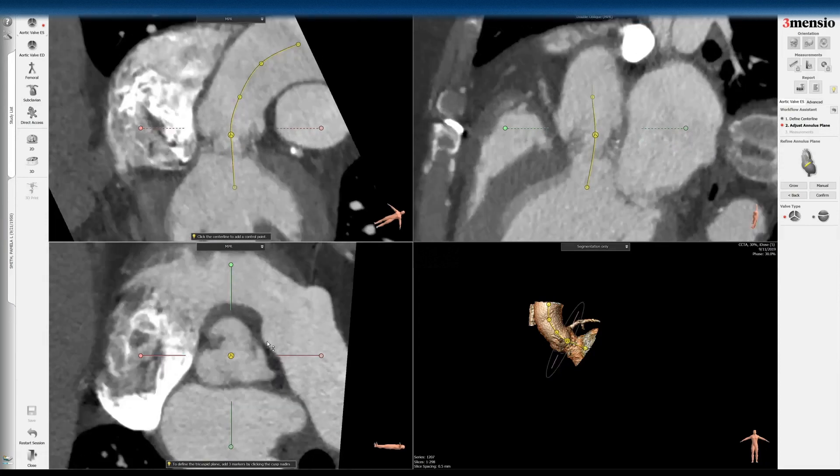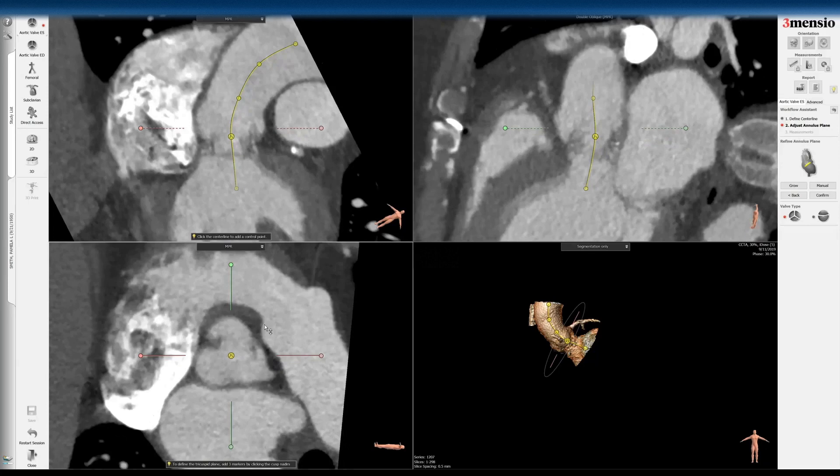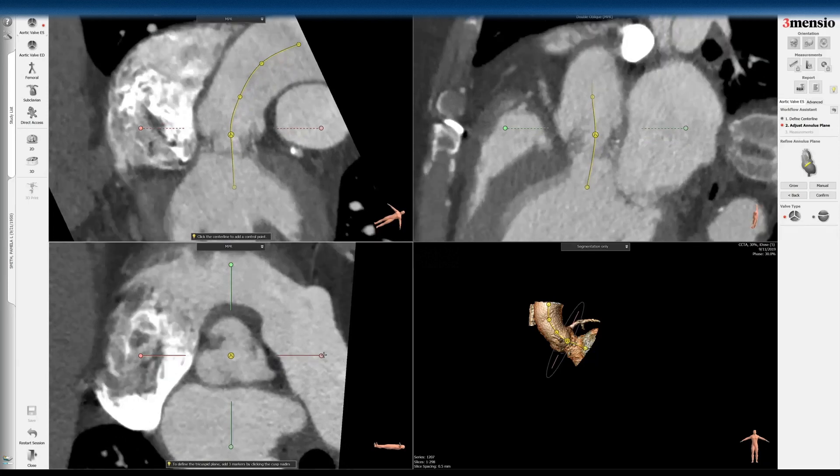Unlike the mosaic valve, which is also a porcine valve, that one has commissure posts identified as dots on the top. So really the only way to do this — it's kind of like what we do with a native TAVR workup.